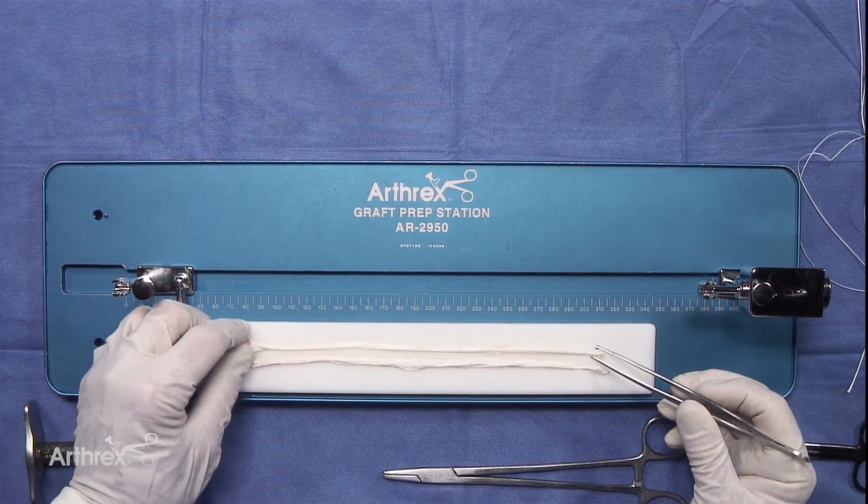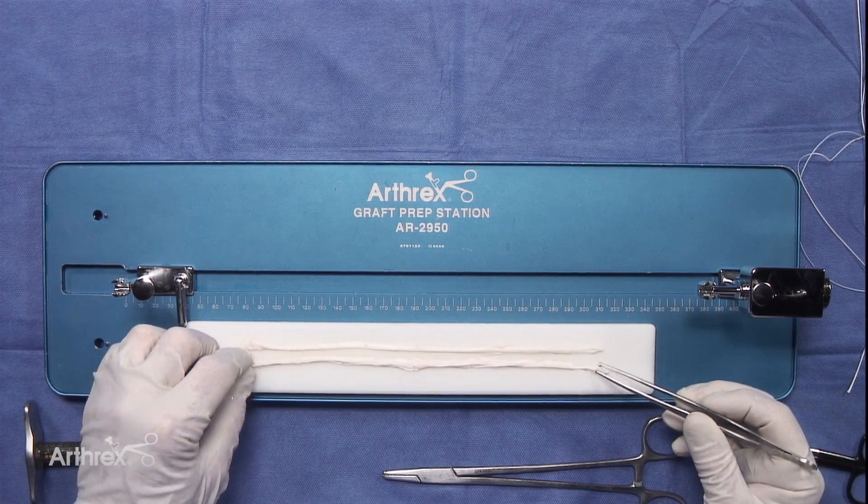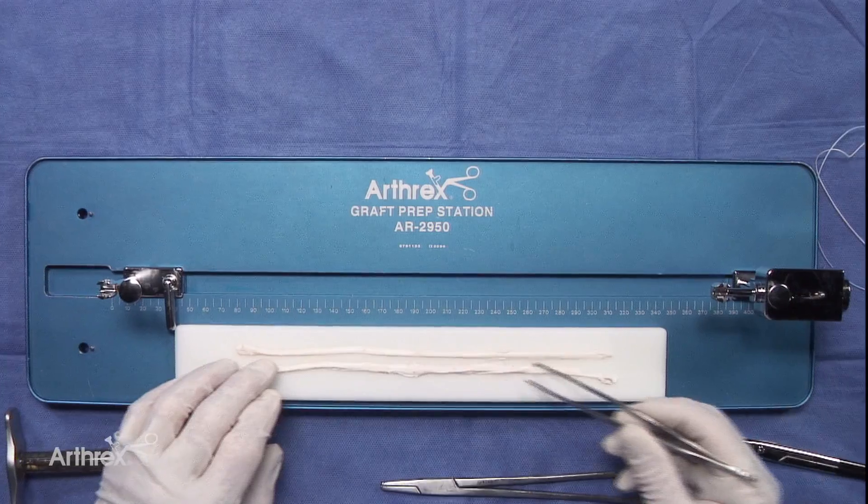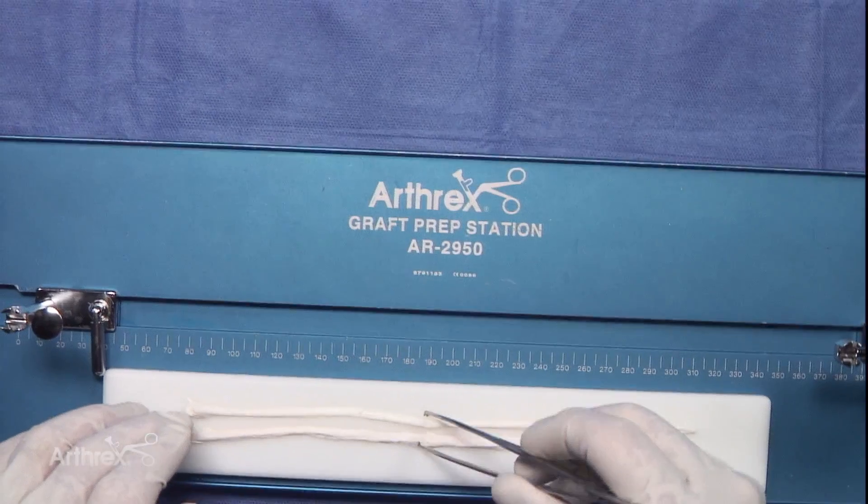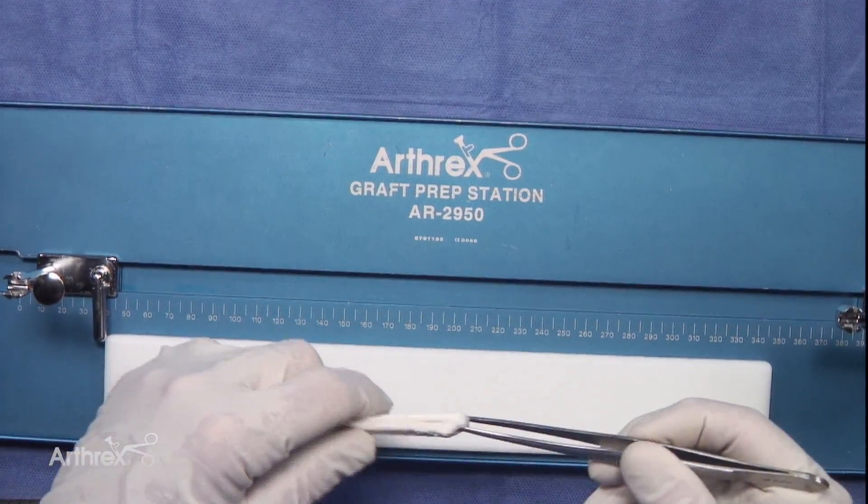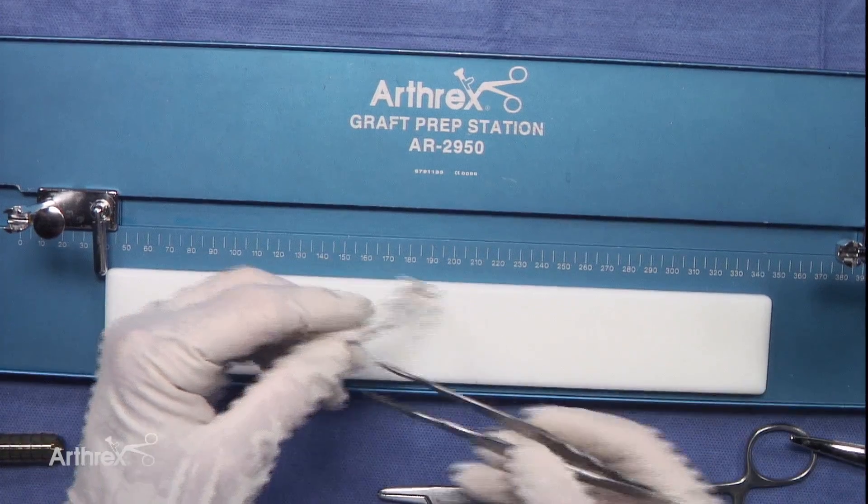This is really a simple technique, and I think that you will find it useful for patients with small stature to increase the overall diameter of the graft. This is a good example of two tendons, gracilis and semitendinosus, and you can see the very small diameter. If you were to take these and double them, we've already measured it, and it's a 7-millimeter diameter.